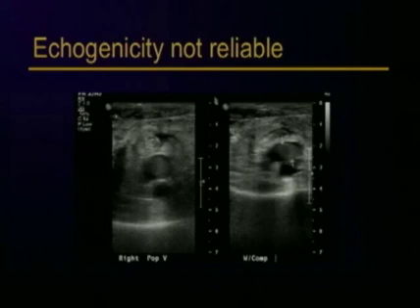Now, as mentioned earlier, echogenicity is not a reliable sign of thrombus age, and acute thrombus may also appear echogenic. You can see that this vein is filled with echogenic material. The vein is enlarged, much larger than the adjacent artery, and then you can see that we are unable to coapt the vein walls due to this thrombus, but also that the thrombus is deformable, which is a characteristic of acute thrombus.